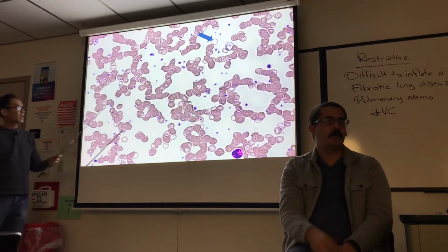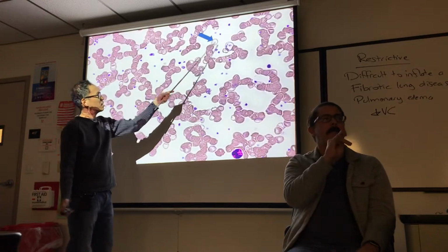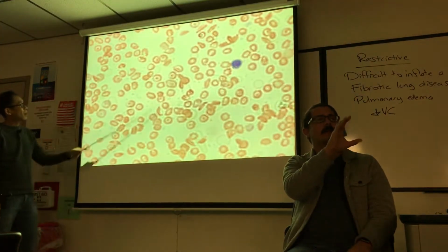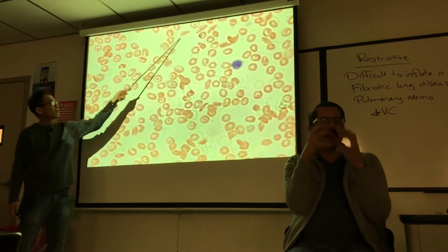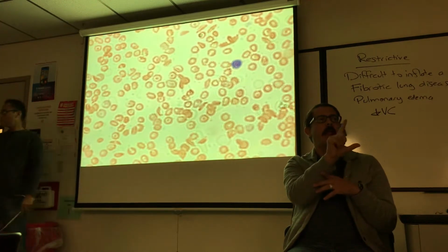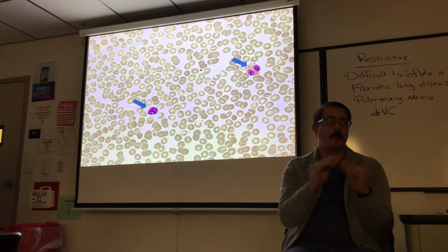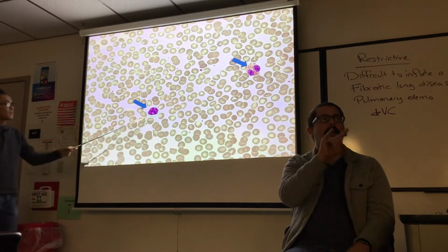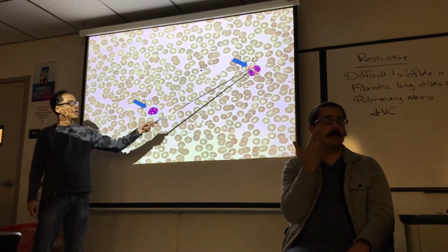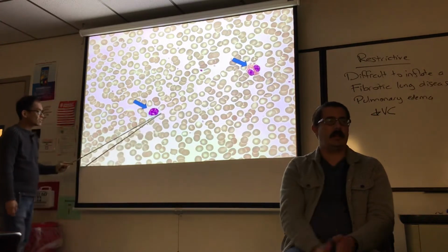This is a condition called iron deficiency anemia. The blood cells are kind of clumping together, and that's a microcyte. Okay. A different kind of anemia called sickle cell anemia. I see puckered cells. I don't see microcytes. This is sickle cell anemia. More blood cells. This is a lymphocyte, and this is one we've seen before. What is it? Red granules? Eosinophil. Okay.